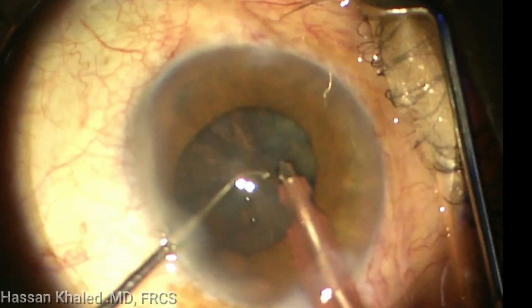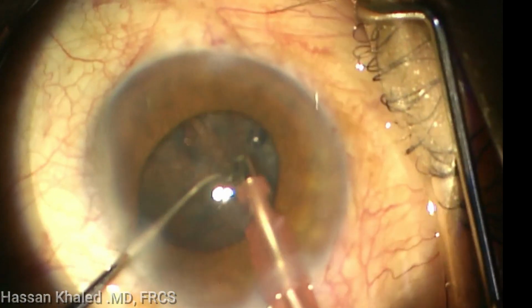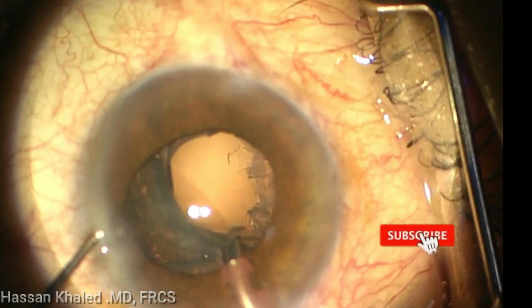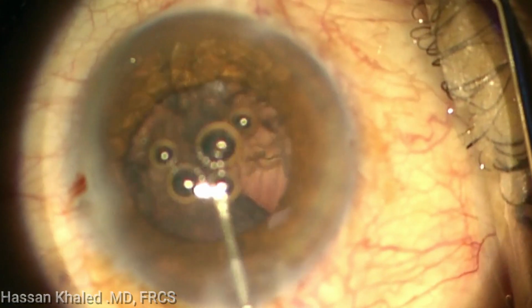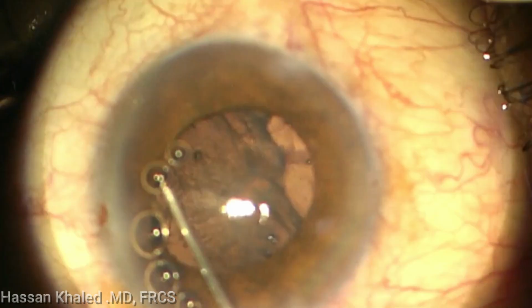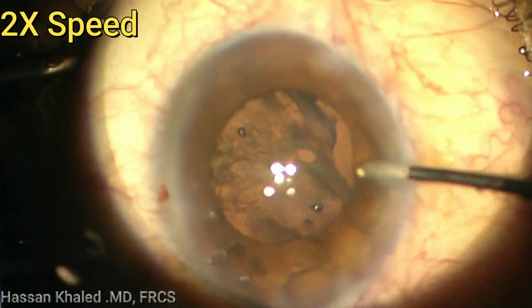Now this is the cortical shell. While I'm trying to aspirate this shell with the phaco probe, I touch the posterior capsule and the posterior capsule is opened. Here it is very important to control your panic and to inject dispersive OVD to prevent prolapsing of the vitreous into the anterior chamber.